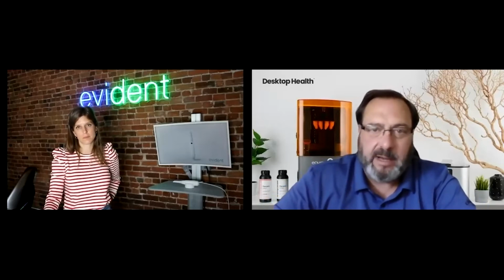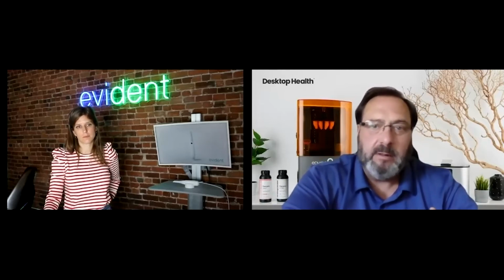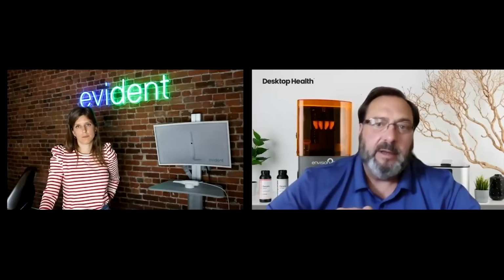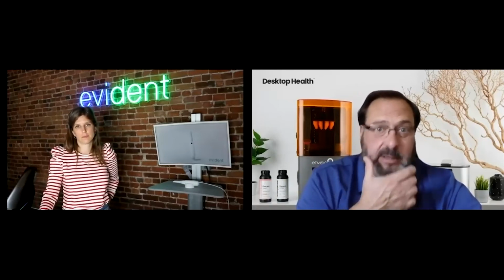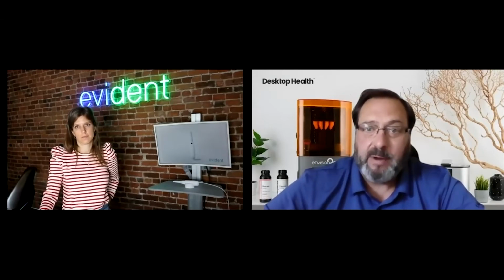Yeah, I absolutely think that's important. There's a couple of ways to do the try-in. I've seen it done 2 ways. You take your regular records, scan it in, print a full denture. Most people will print a monolithic denture, which means they'll print it out of the tooth shade, so let's say it's an A1. Then that A1 goes in, and the patient can see the smile, the teeth, whether they accept that or not. Take a wash impression and do your try-in and make your adjustments. It can be scanned and then goes back into the design, where the design center comes back with the corrected amount, and then it goes to a final prosthetic. So it can be done either way.